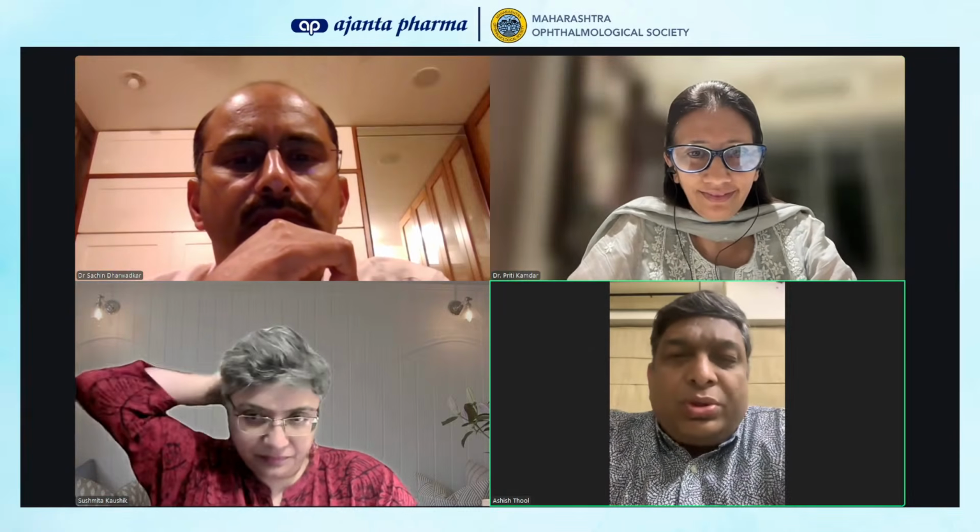All right. What about you, Dr. Ashish? You're muted, you can just unmute yourself. Yeah, for all OCTs for glaucoma we do both RNFL as well as the GCIPL. Cirrus is the machine that we are using, and we use Humphrey. In the same way, although we are talking about OCT, I would like to say that in most cases, with 24-2, nowadays we are doing 10-2 also.